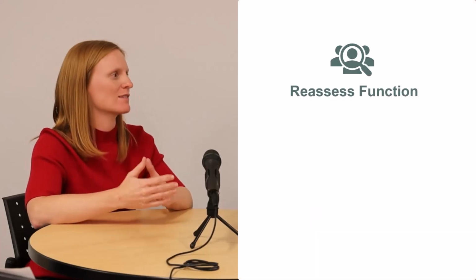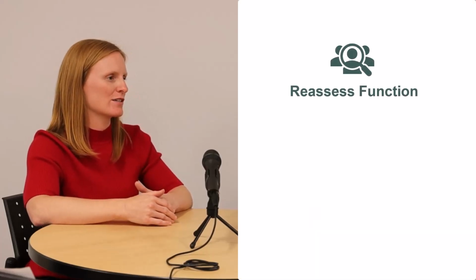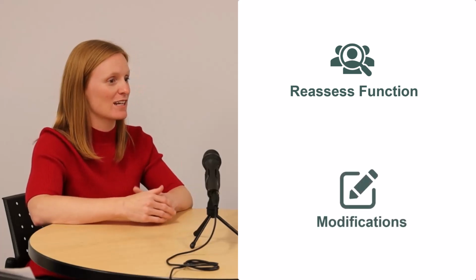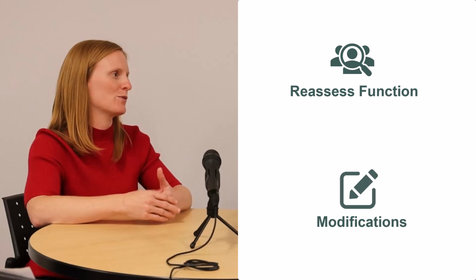Yeah, that's the ultimate question, right? I always want clinicians to redo those functional assessments like the fvHIT to understand, has my patient improved? Can I modify the exercises? Can I make things a little bit harder? Or do I need to make things a little bit easier so they continue to progress through rehab?